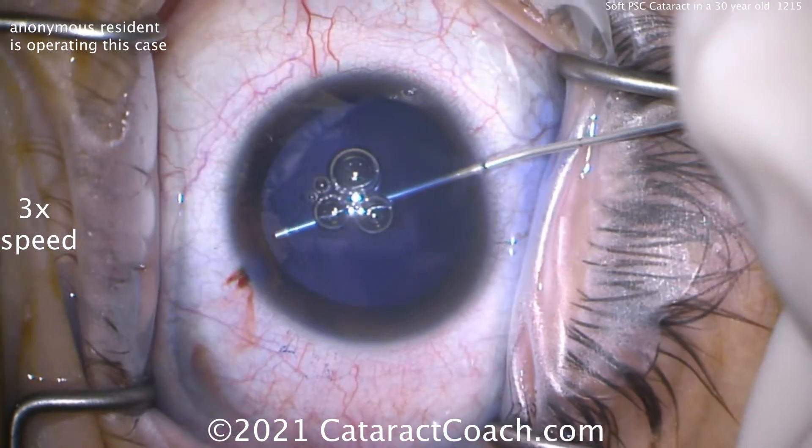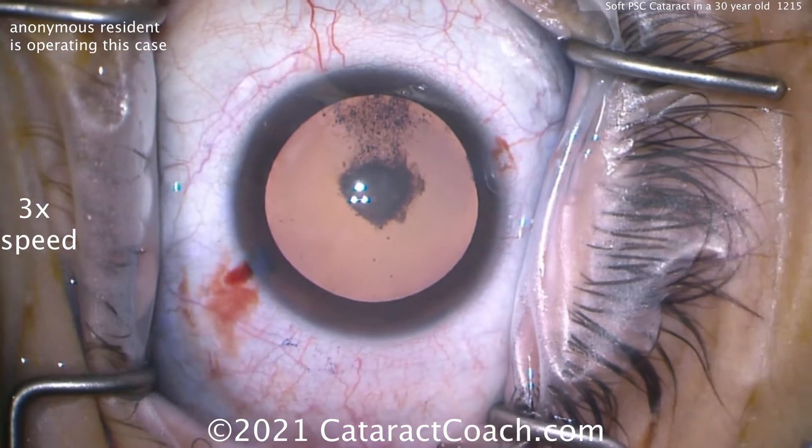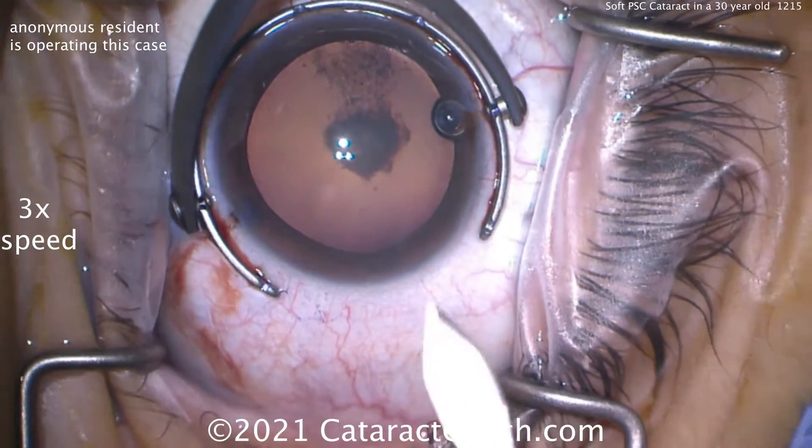Trypan Blue dye is used. Here's the viscoelastic now going in the eye. Why do you need Trypan Blue if there's such a good red reflex? Well, remember, another benefit of Trypan Blue dye is it also makes the lens capsule a little less elastic.